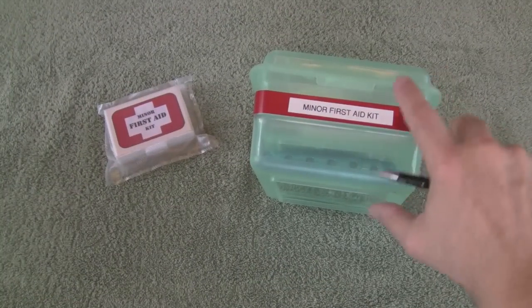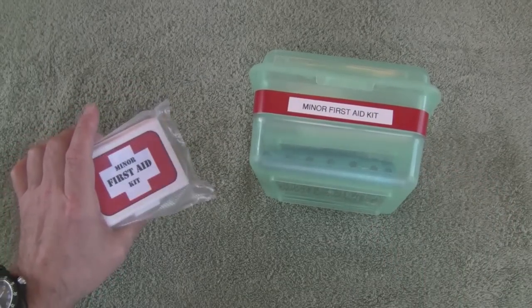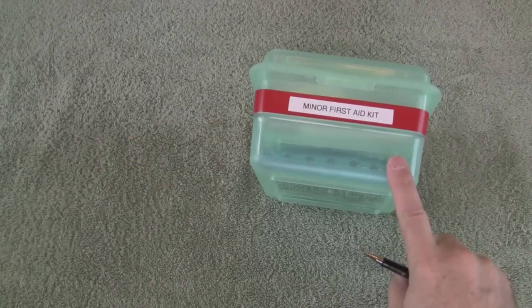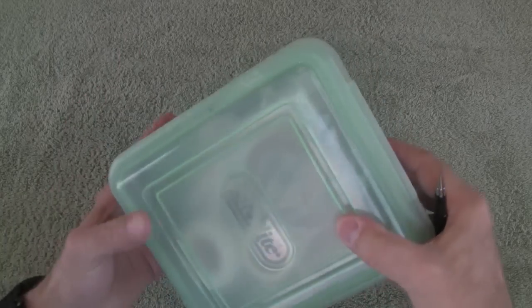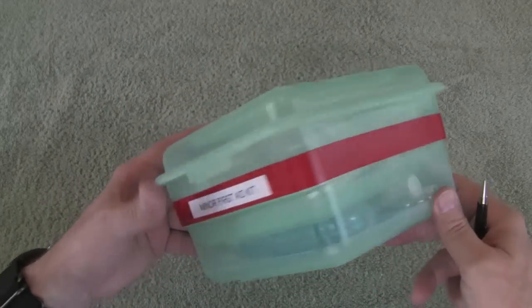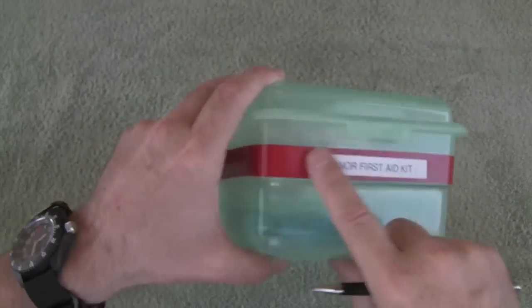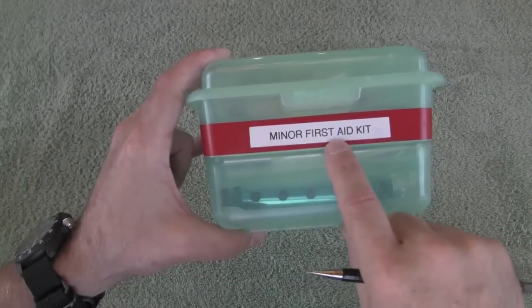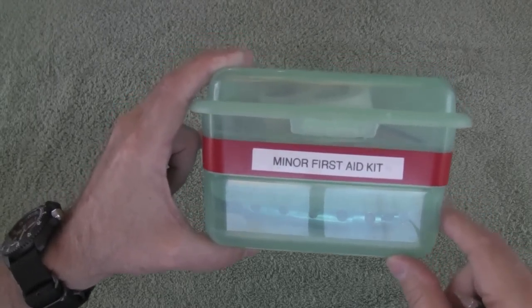We're going to do this in two parts. We'll go over the minor first aid kit first and then the pocket first aid kit second. This is the minor first aid kit that we use in our house. It sits in one of our kitchen cupboards, pretty easy to grab. It's in a Sterilite — I think these are CD cases — they're pretty inexpensive, $1.99 I believe. It has a piece of red electrical tape around the outside edge just to help identify it as the minor first aid kit, and that's actually what you see sitting on the shelf. Let's open it up and see what's inside.